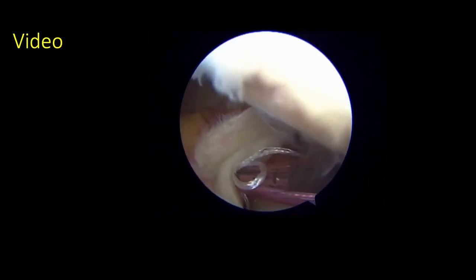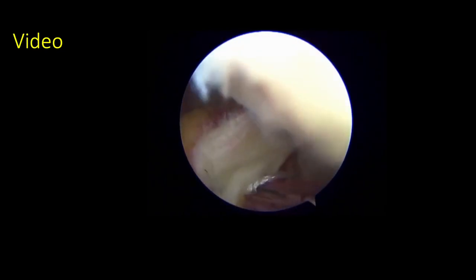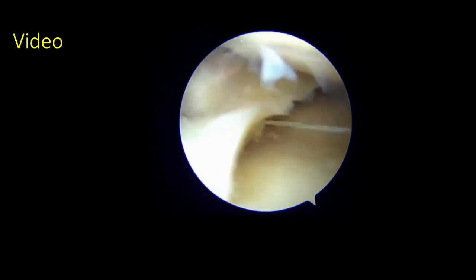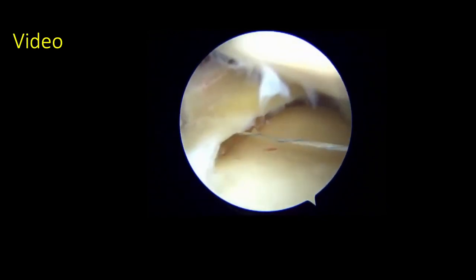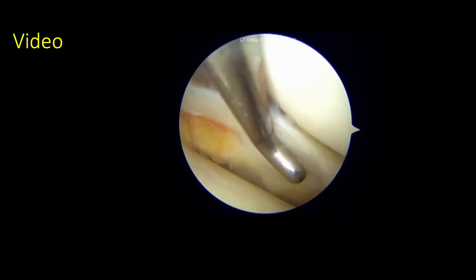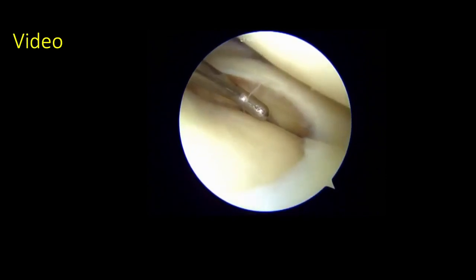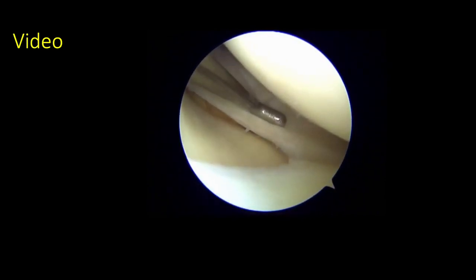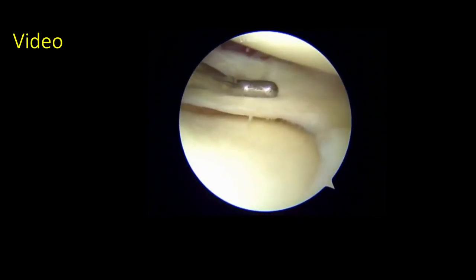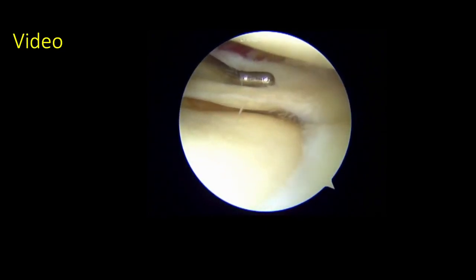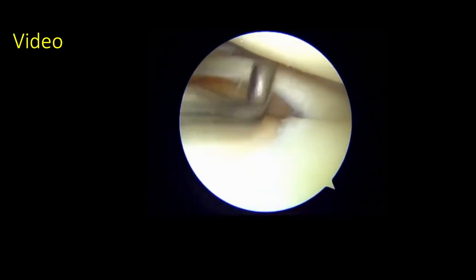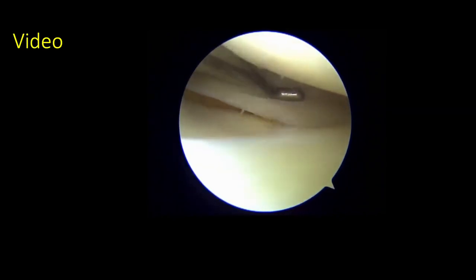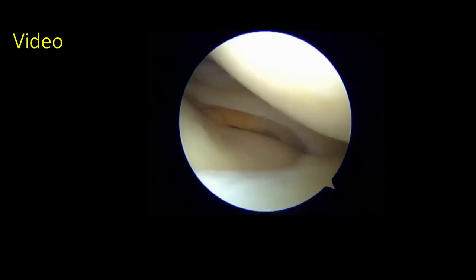A flexible all-inside device makes it possible for easy deployment of the suture. The scope is then switched to the anterolateral port and the probe is passed to palpate the posterior inferior fascicle. A fourth suture is taken through the inferior surface of the meniscus to repair the posterior inferior fascicle of the lateral meniscus, avoiding the popliteus tendon.